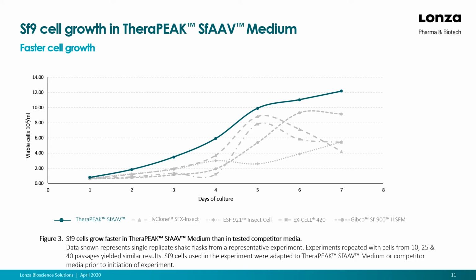In addition to the growth performance, we evaluated the production of lactic acid and ammonia by SF9 cells in the different media.